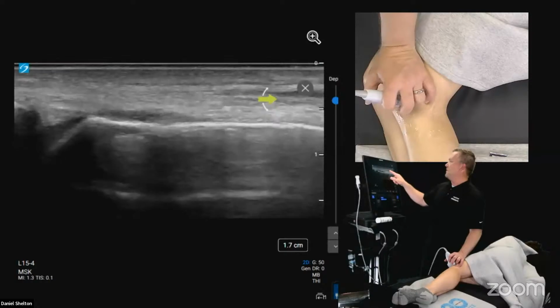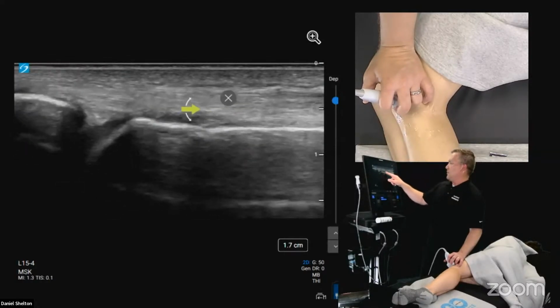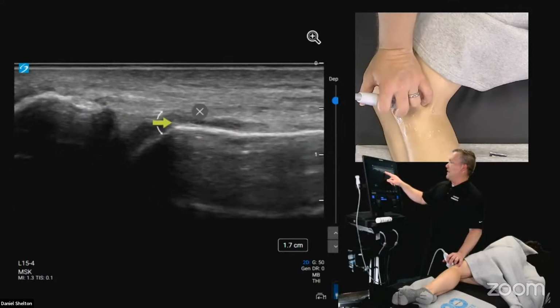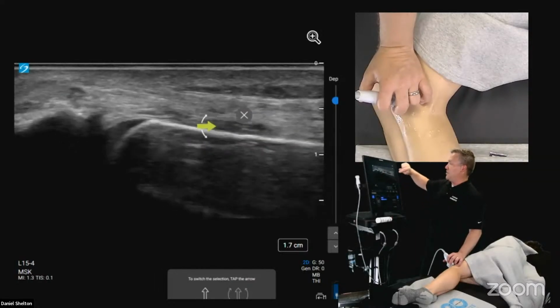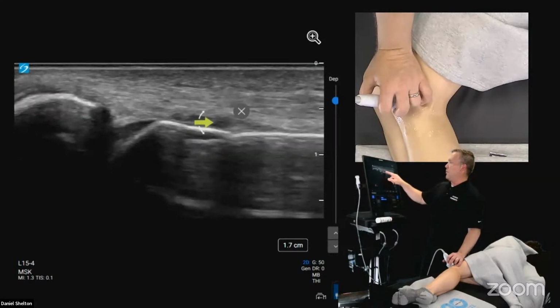Patellofemoral retinaculum, which blends into the IT band in this slice. But you can see this dark layer here. That's the synovial gutter on the lateral aspect of the suprapatellar recess, and it's nice and thin. So when there's synovitis, it will look like a folded sponge. You'll see a thick, homogeneous folded wall instead of a very thin hypoechoic wall.